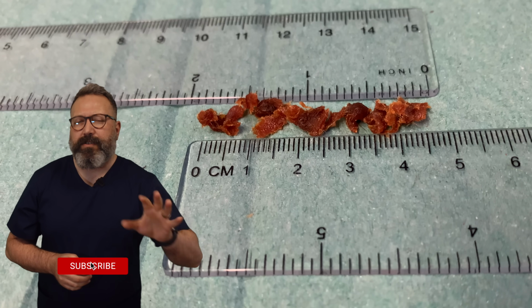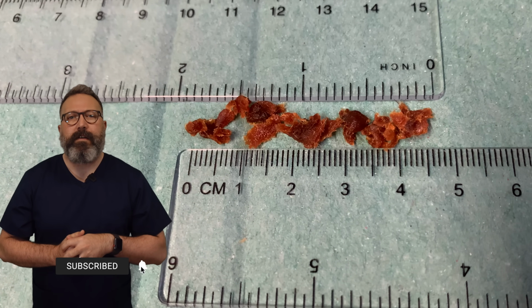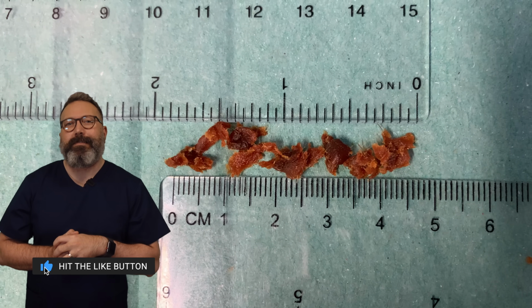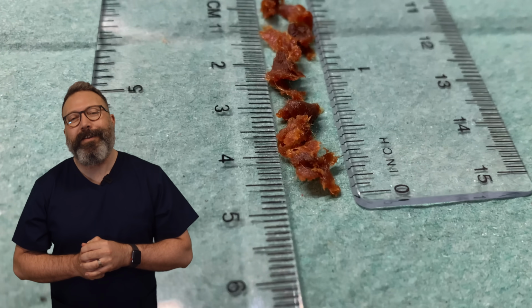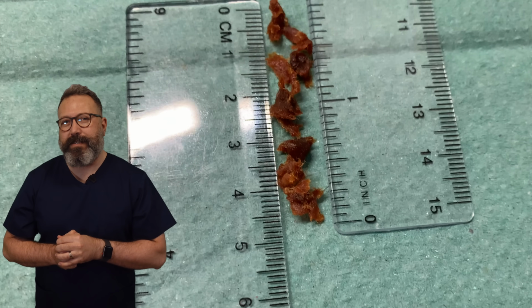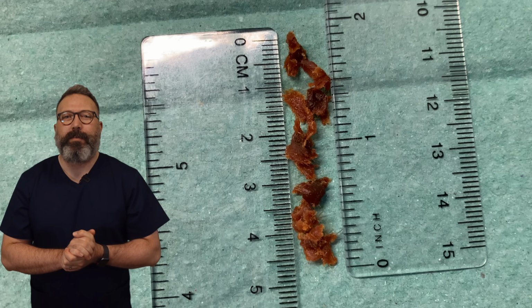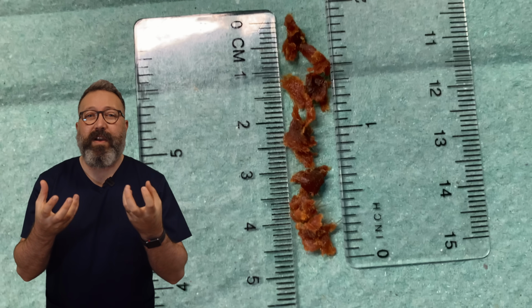I did show you the eardrum, didn't I? Sorry. Right, so we got 4.5 centimeters. I'm going to be easy with the ruler, and inches, 1 3/4 inches, 7/8, round about that mark. So you can see quite a bit came out. This conker color, this reddy brown color.